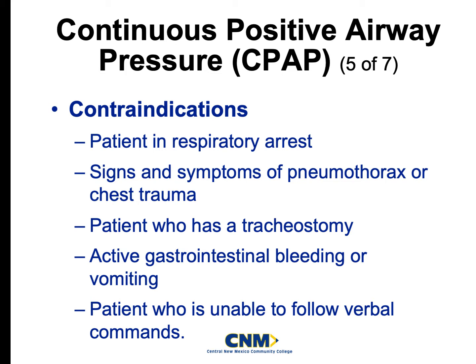Any signs and symptoms of any sort of chest trauma, stabbings, significant bruising to the chest wall, right? Symptoms of a pneumothorax. You might not be able to hear lung movements in one side. The last thing we want to do with that is increase the pressure of a lung that's blown, because we're really doing some serious squeezing inside of our thoracic cavity. We're increasing that pressure way too much. We just don't want to use it with trauma patients, specifically trauma patients that are showing signs and symptoms of chest trauma.